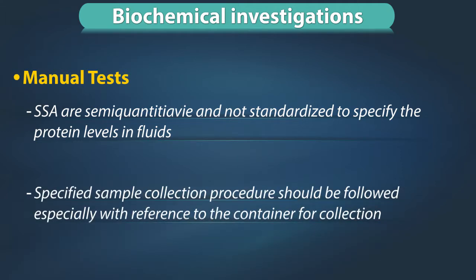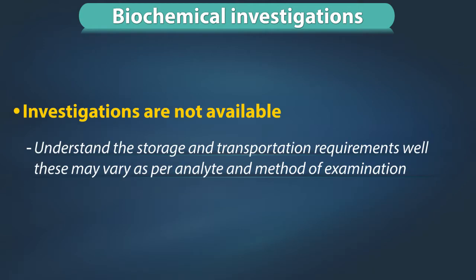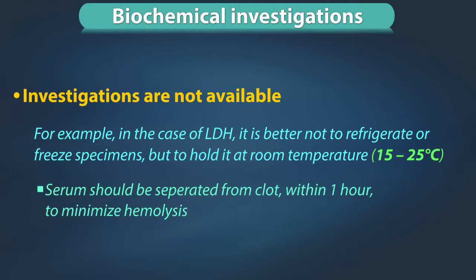Also, the specified sample collection procedure should be followed, especially with reference to the container for collection. If the investigations are not available in your lab, you must understand the storage and transportation requirements well. These may vary as per analyte and method of examination. This can be understood from the referral lab. For example, in the case of LDH, it is better not to refrigerate or freeze the specimen, but to hold it at room temperature at 15 to 25 degrees centigrade. Serum should be separated from the clot within 1 hour to minimize hemolysis.